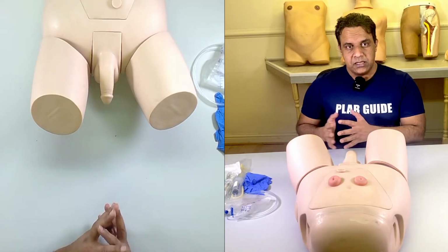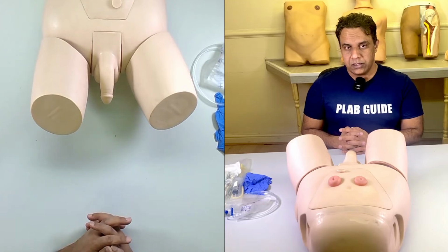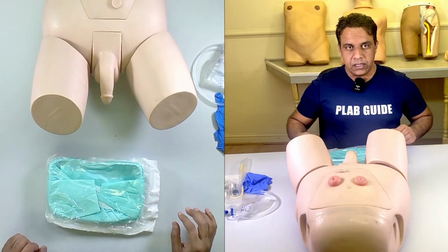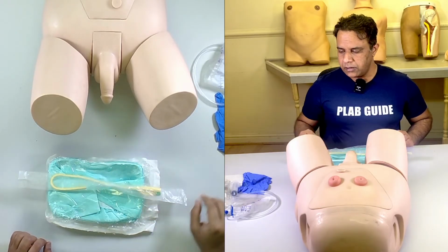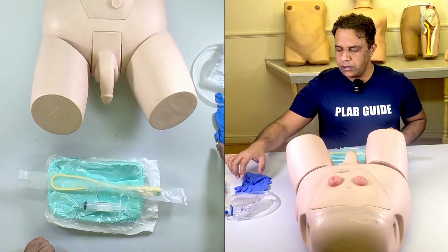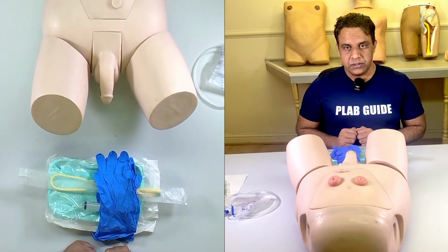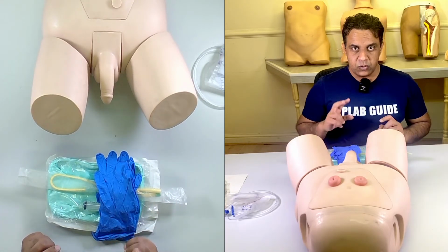Then the next thing that you want to do is collect all the material. So let's start. We need the catheter pack, and we need a catheter. We need instillagel that is usually packed, and we will need 2 pairs of gloves. So for this procedure we need 2 pairs of gloves.